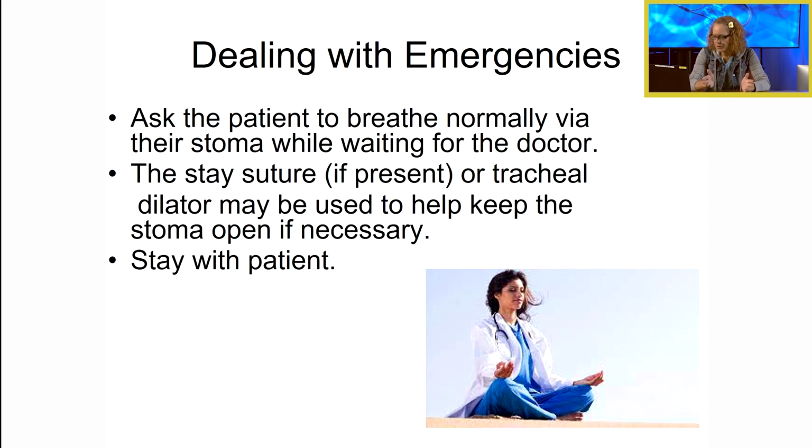Ask the patient to breathe normally via their stoma while waiting for the doctor. Sometimes there's a stay suture, if present, or a tracheal dilator may be used to help keep the stoma open if necessary. But just stay with the patient, be calm, reassure the patient, let them know that help is on the way, okay?